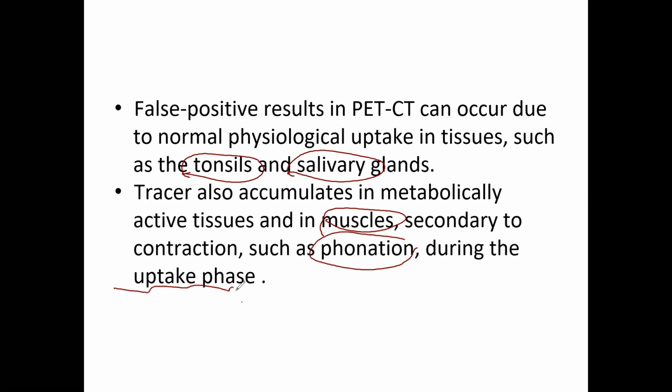You should have it in mind for the uptake phase. You will have the muscles of the vocal cord, so keep that in mind. The vocal cords can get a lot of concentration over there.